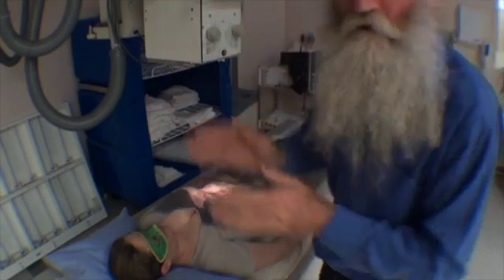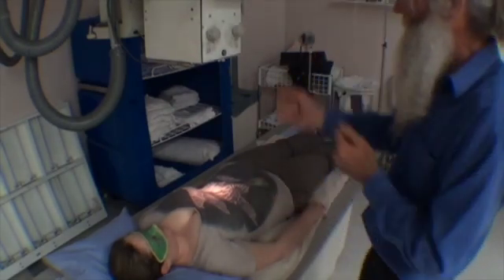Everything is exactly right. My system of radiography makes sure that everything is double checked — this is right, that's right, patient's right, everything's right.